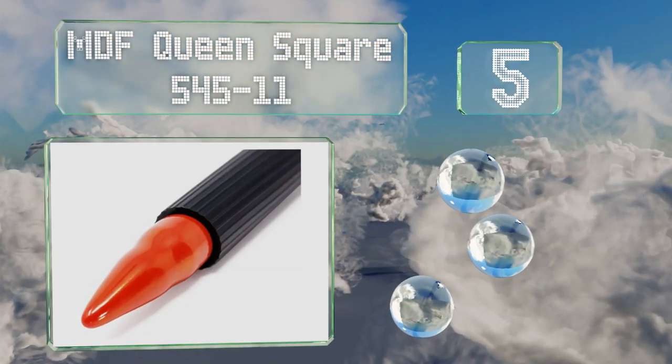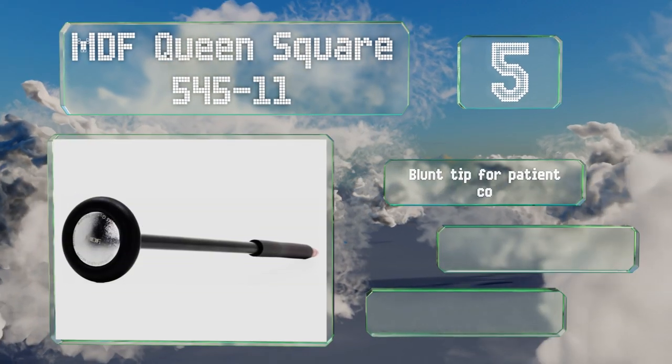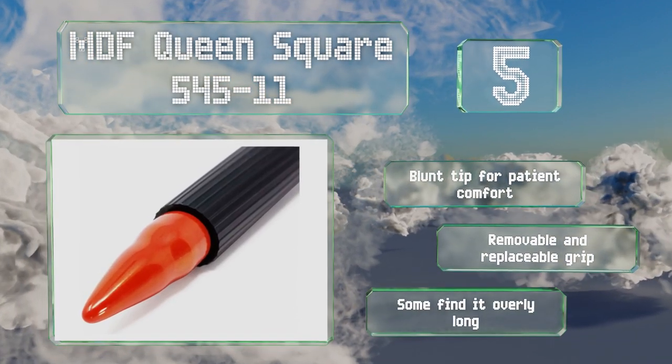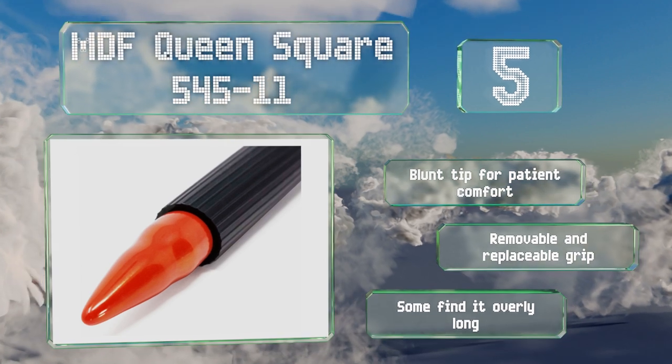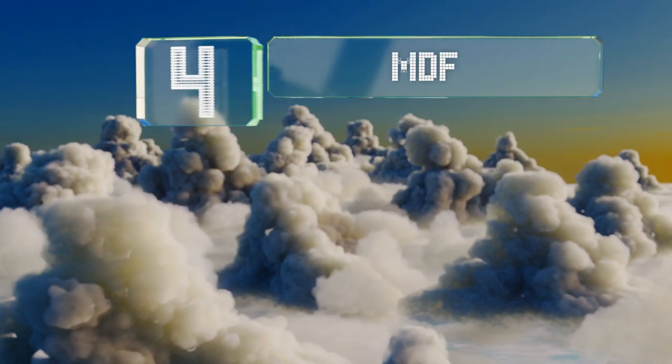At number five, the MDF Queen Square 545-11 is surprisingly affordable considering the build quality and number of features. Its flexible nylon handle helps you produce a better hit with less force, and the bright red point on the bottom can be used for visual tests. It's equipped with a blunt tip for patient comfort and a removable and replaceable grip, but some find it overly long.